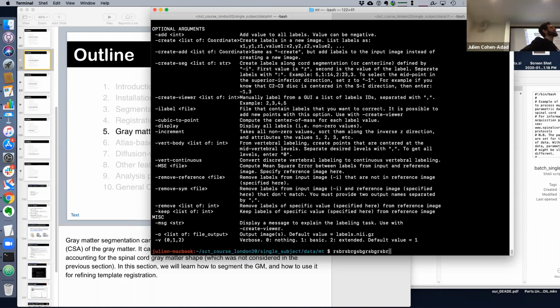What's the threshold for the interpolation? So the white matter mask is not binary, it's a soft mask that we output. For linear interpolation, it's 0.5. It's not binary. Actually, we recently, you know what? I'll mention it because it's relevant information.